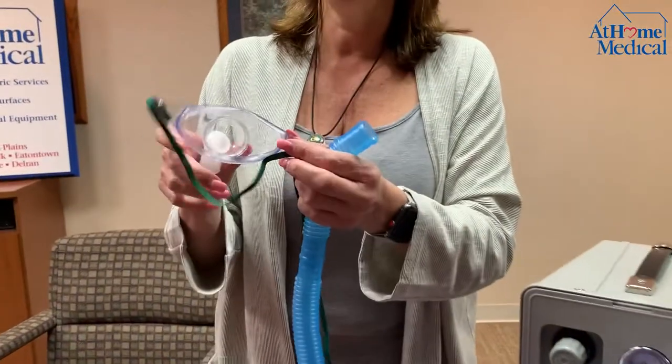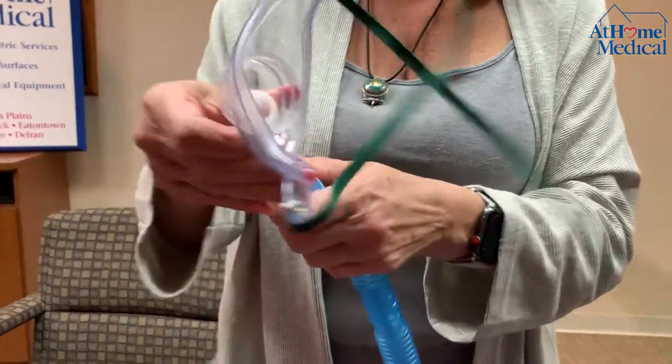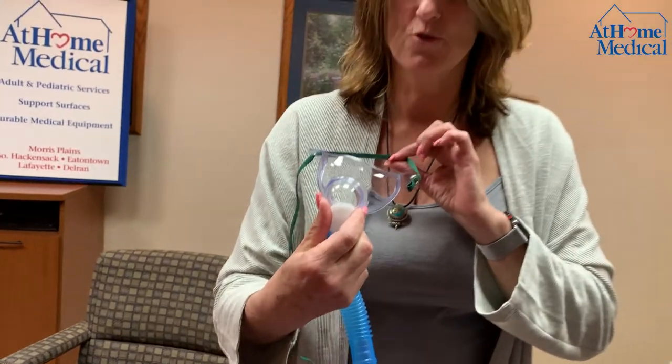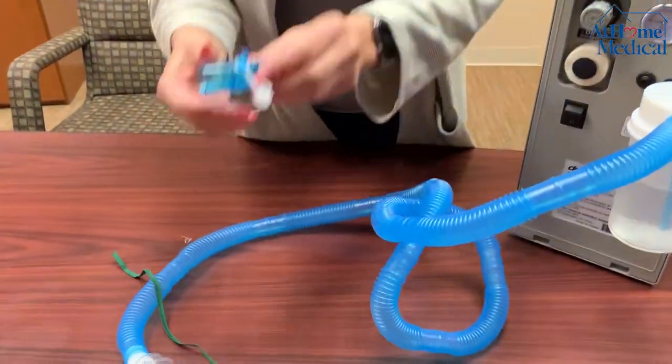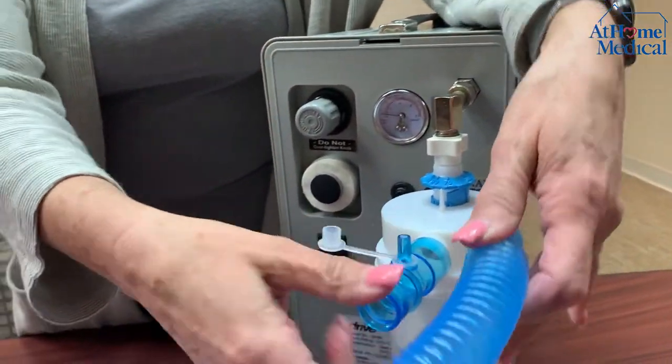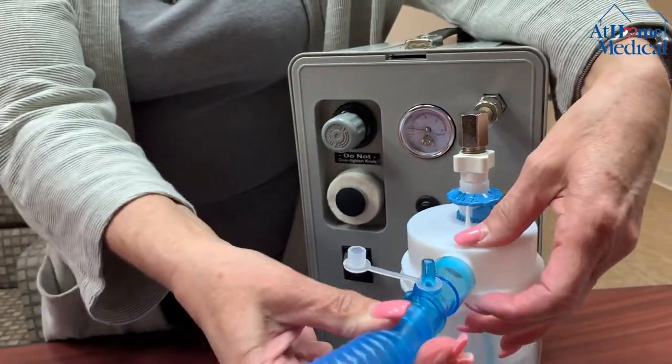The other end connects to the trach mask, which then goes around onto the trach. Now if you're using oxygen, you're going to take this piece called a U-adapter and put it onto the bottle, connecting it to the other end.